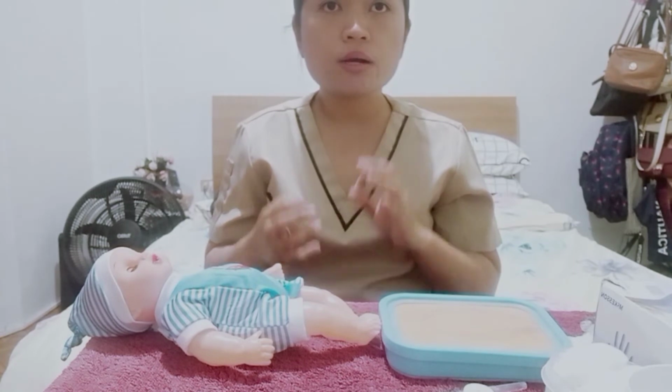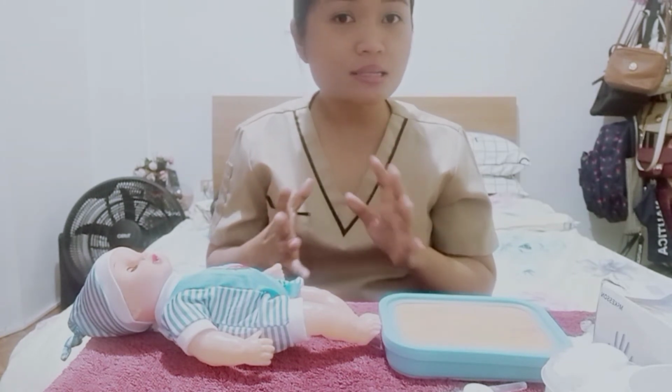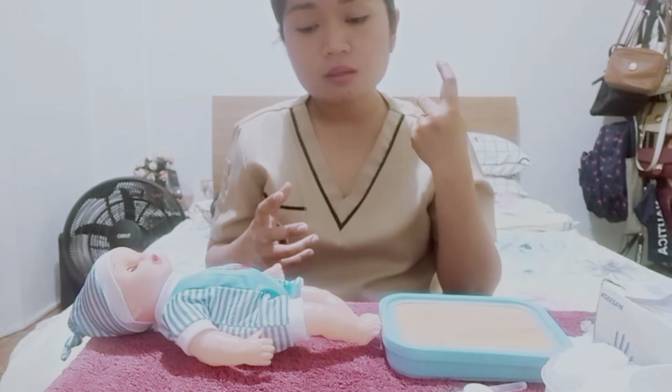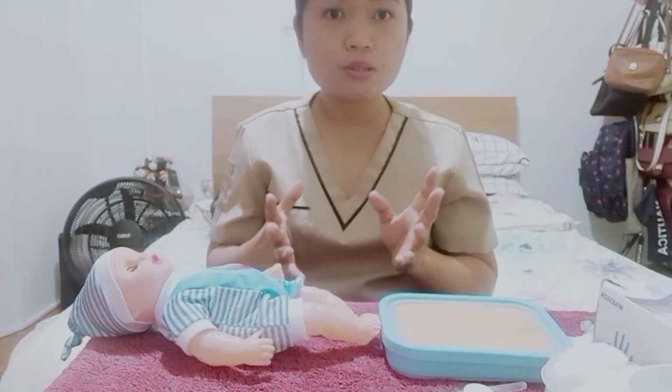And after we've injected the vaccine, we make sure that we don't draw back. It's not necessary for us to draw back from the syringe. We can just inject it right away. Okay, so that's how we are going to do the IM injection.